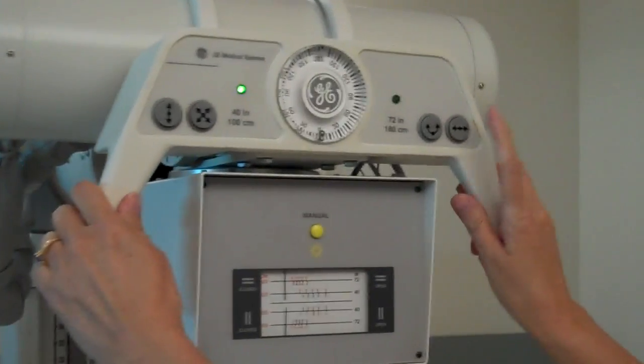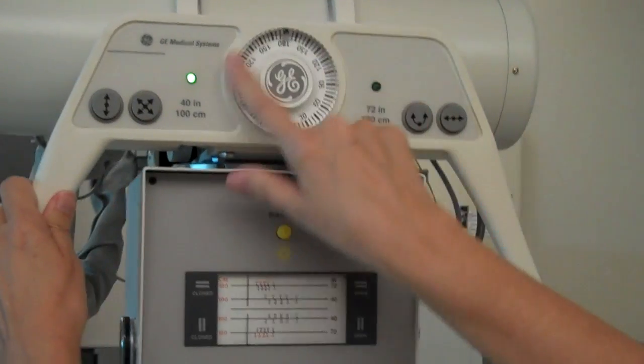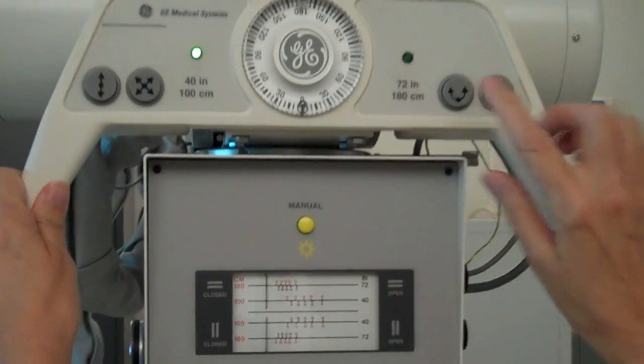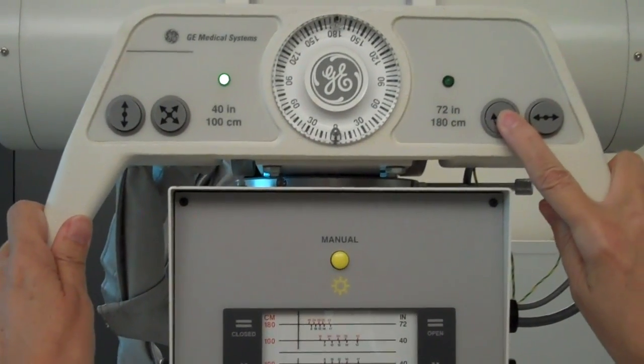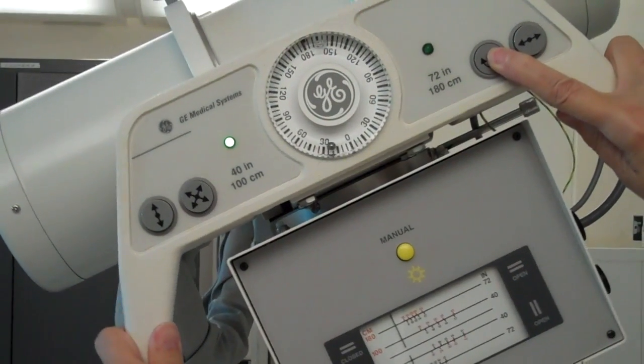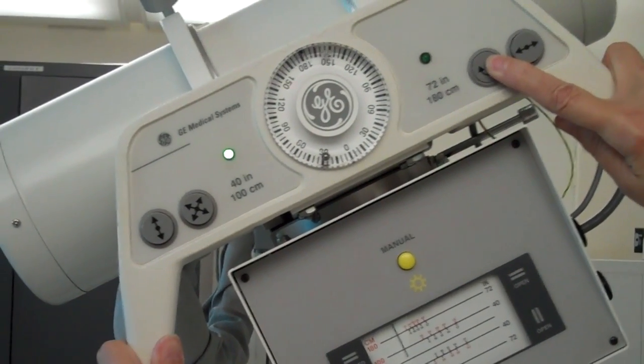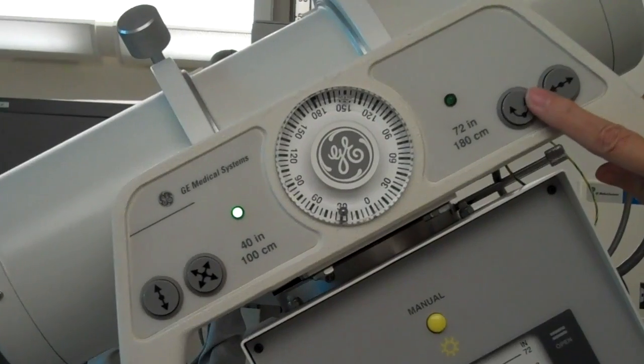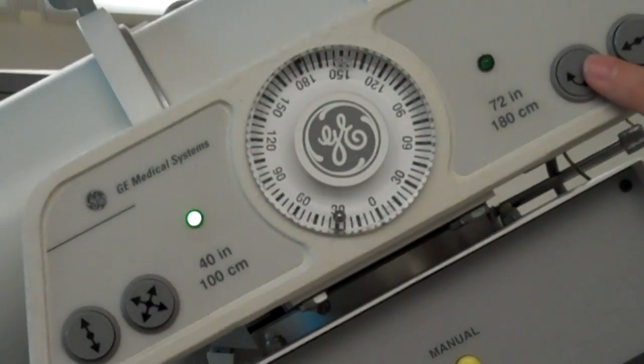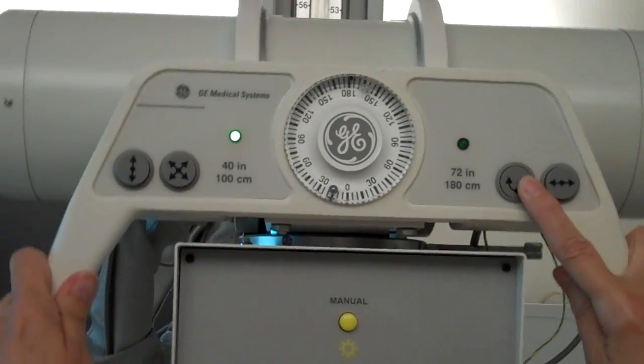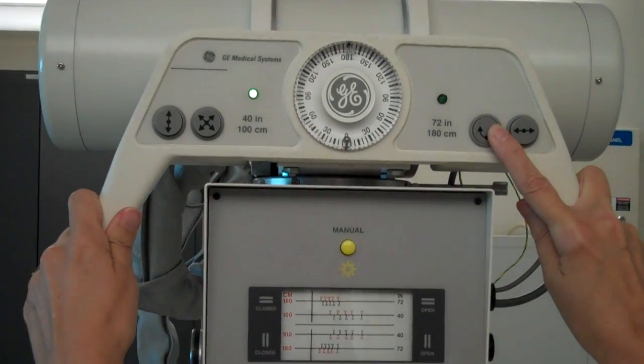If you need to angle your tube, there is an angulation chart. And you select the angle button and rotate the tube the amount that you want. This would be at 30 degrees. And we'll go back to a vertical or 0 degrees.